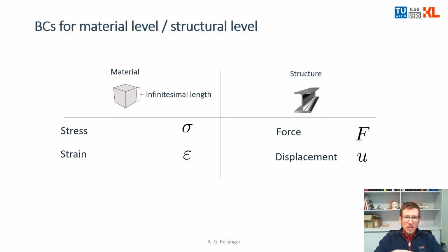When we consider boundary conditions for our mechanical tests, we have to think first about what we would like to measure. I introduced the concept of material properties and structural properties the last time, and this is something you have to decide beforehand before you design your boundary conditions. First, we would like to look into boundary conditions to make tests on the material level.